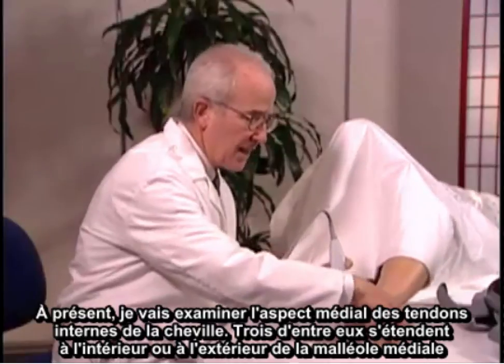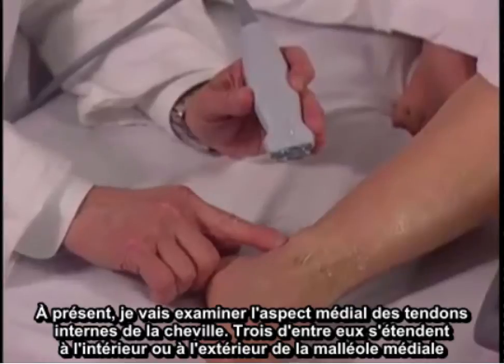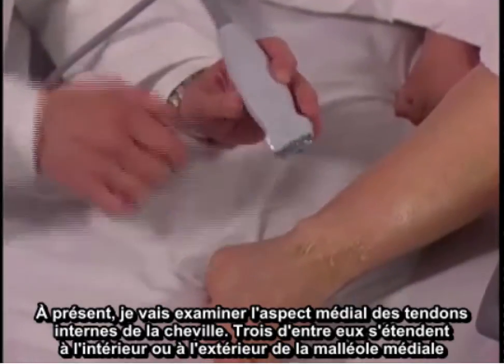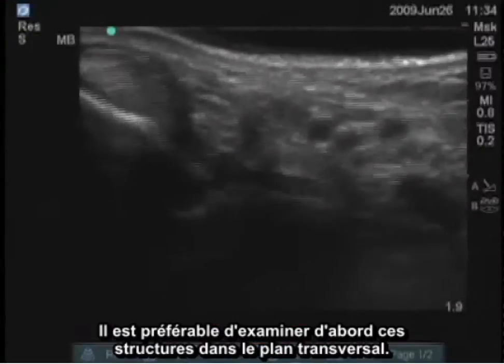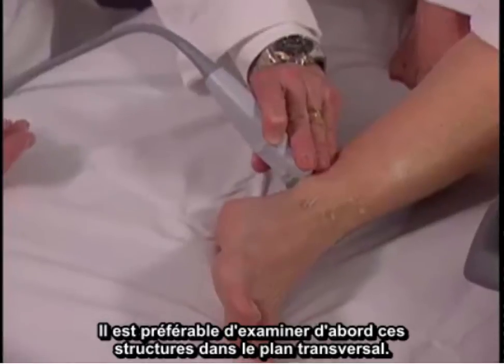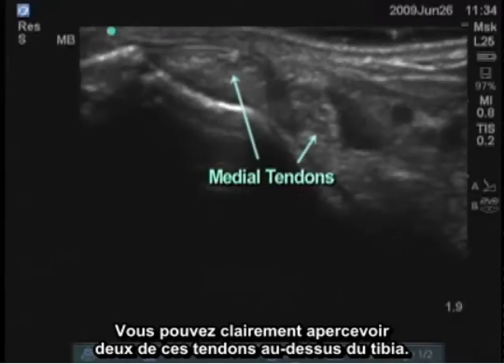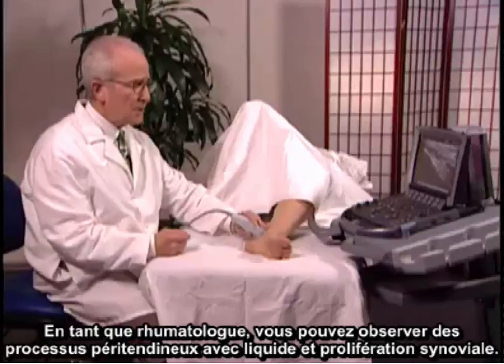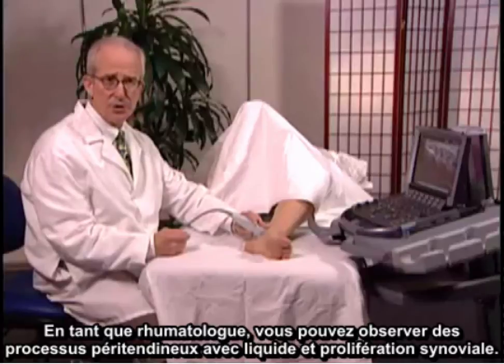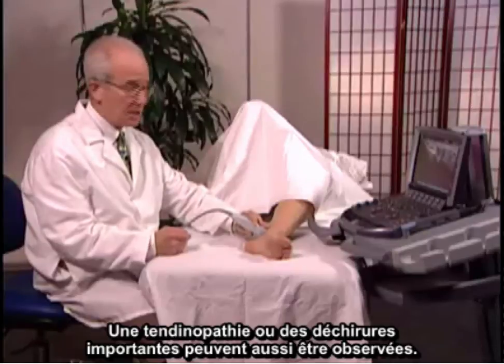Next I'm going to examine the medial aspect of the ankle. Three medial tendons run just inside or just posterior to that medial malleolus. It's best to examine these initially in the transverse plane. You can see two of those tendons very clearly, right superficial to the tibial bone. As a rheumatologist, you can see peritendinous processes with fluid and synovial proliferation, and you can also find large tears or tendinopathy.